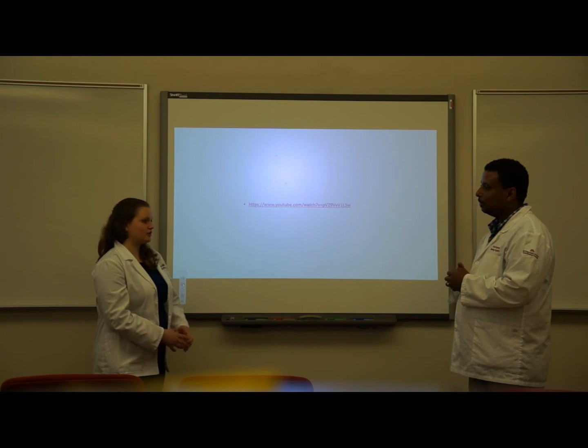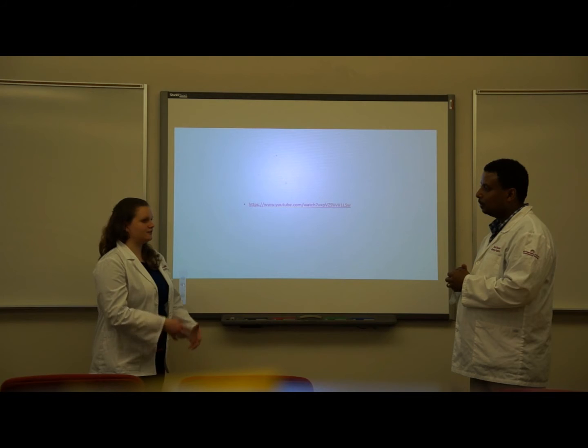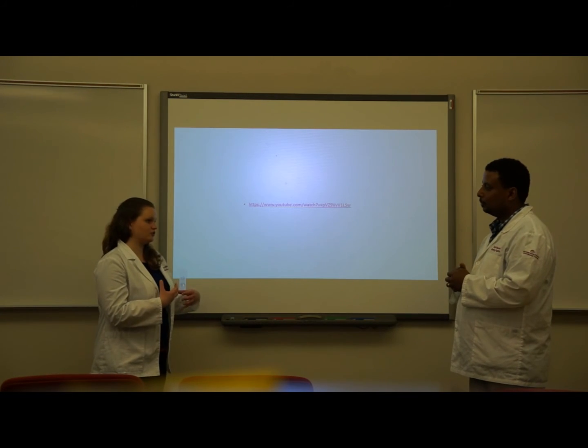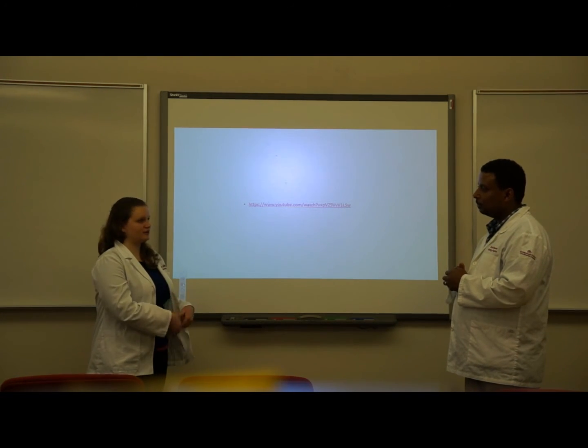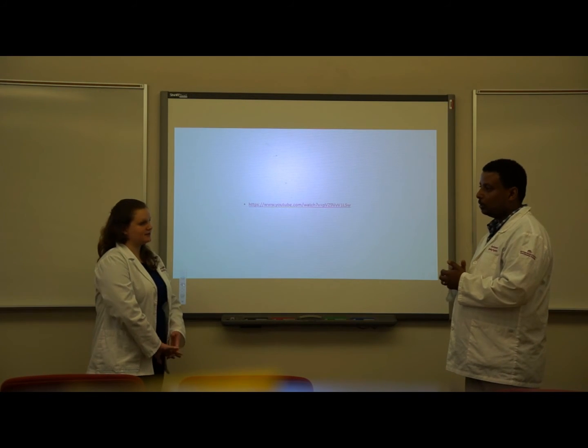You could have right ventricular failure due to the left ventricular being supported and now the right ventricular is overloaded. You could have infection related to the surgical site, related to the driveline site. Very good. That's very good.